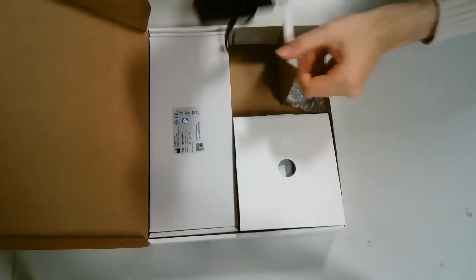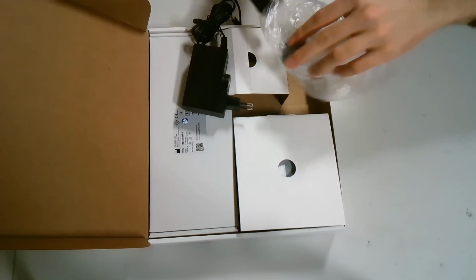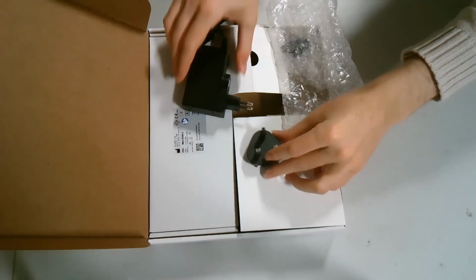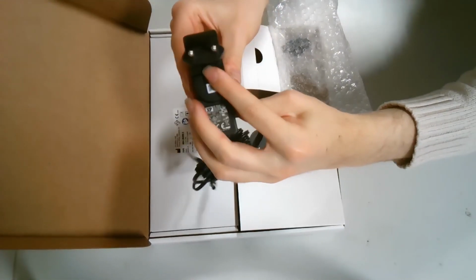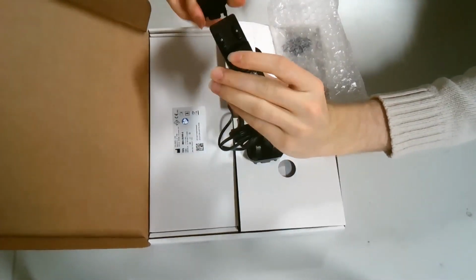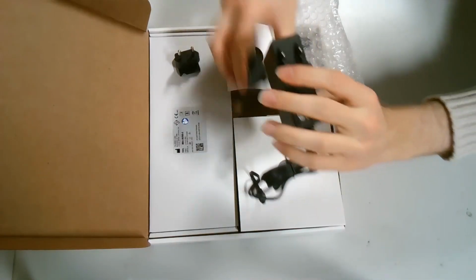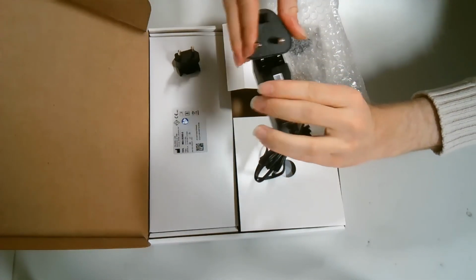You can change the plug on your electrical power adapter to suit the sockets where you are. Press the button next to the plug and slide the plug sideways to remove it. Slide the new plug onto the contacts.